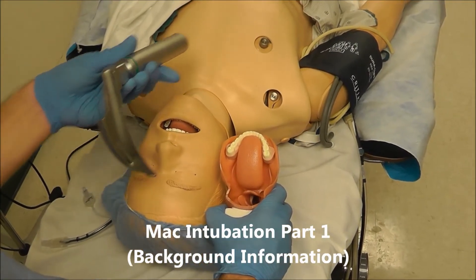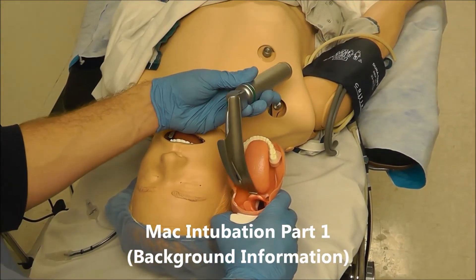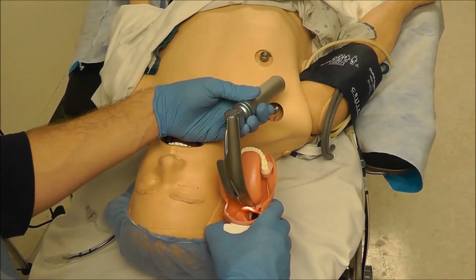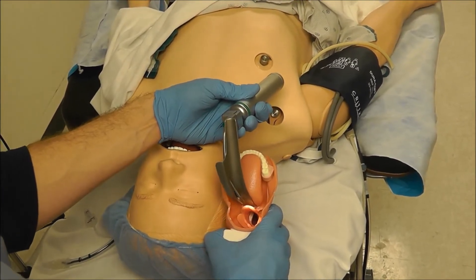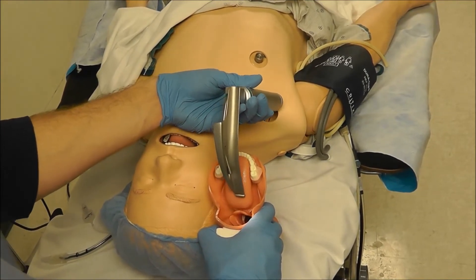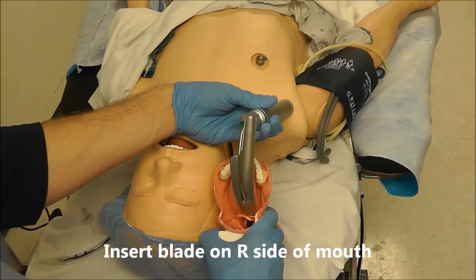When intubating with a MAC blade, we want to make sure that the distal tip of the blade gets into the vallecula and that we can see the epiglottis before we lift. The other thing we want to make sure is that we are inserting the blade on the right side of the mouth.